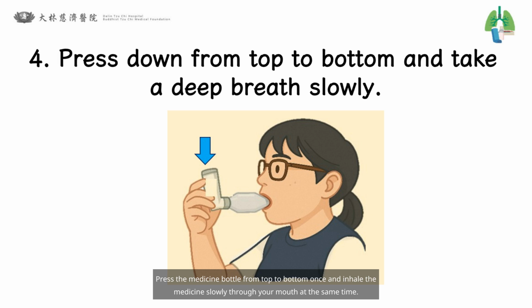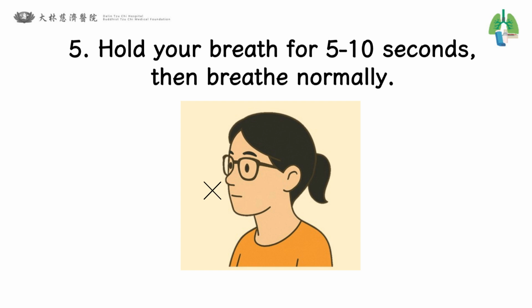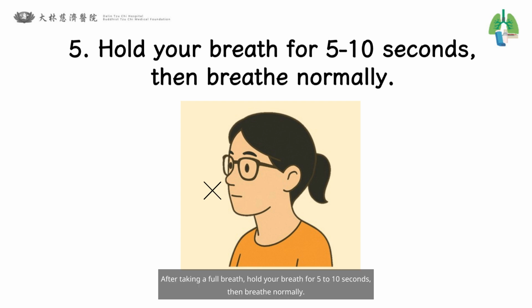4. Press the medicine bottle from top to bottom once and inhale the medicine slowly through your mouth at the same time. Inhalation time is about 3 seconds for children and 4 to 5 seconds for adults. 5. After taking a full breath, hold your breath for 5 to 10 seconds, then breathe normally.